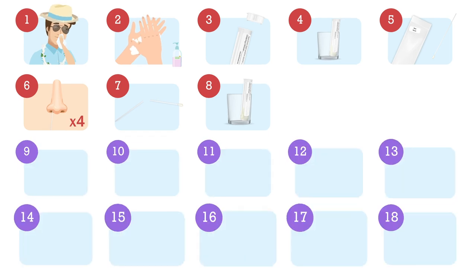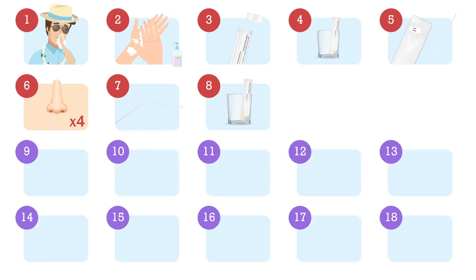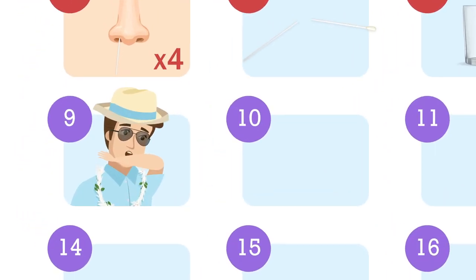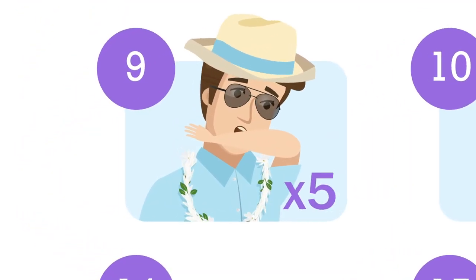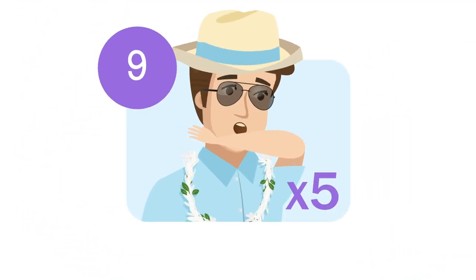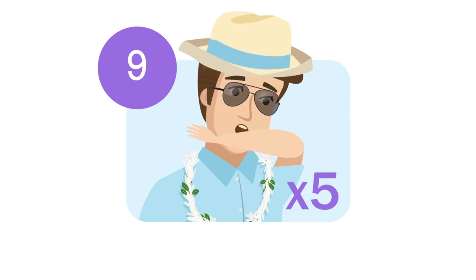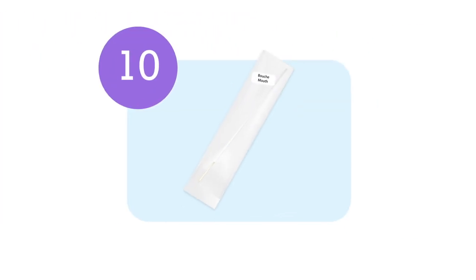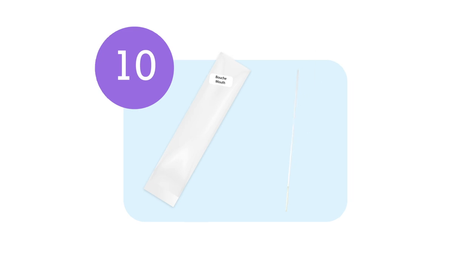Then proceed to the oral sampling. Start by taking a deep breath, then cough five times in your elbow. Remove the swab for the oral sampling from the wrapper by holding the plastic handle. Make sure not to touch the cotton tip.